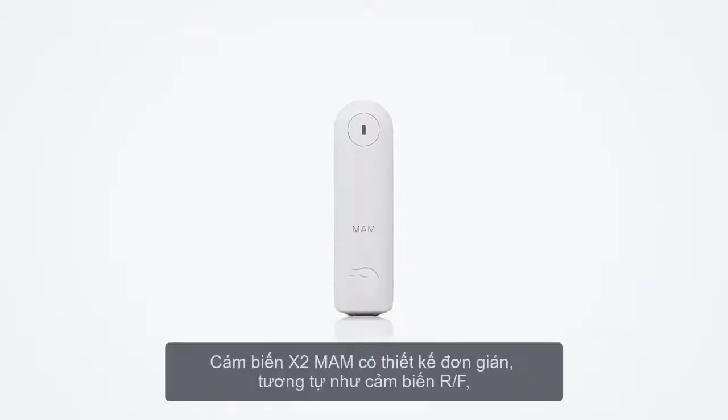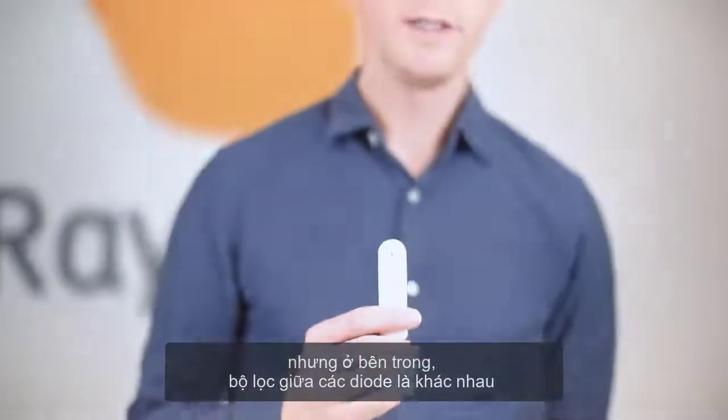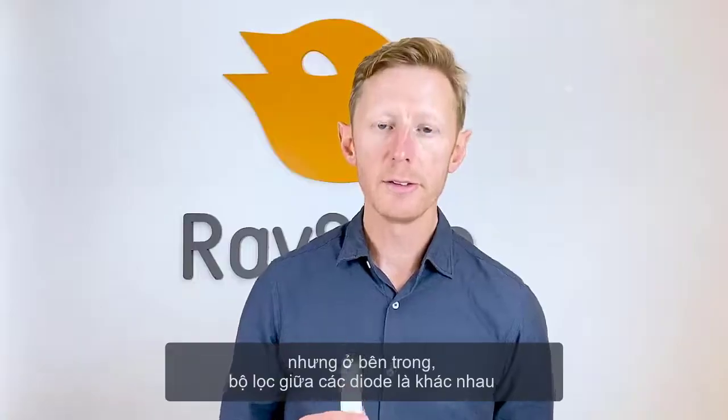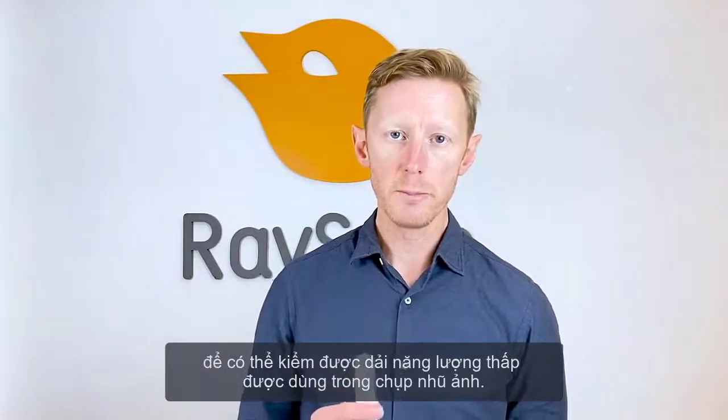The mammography sensor has a similar design as the RF sensor, but on the inside the filtration between each diode is different to cover the lower energy ranges as used in mammography.